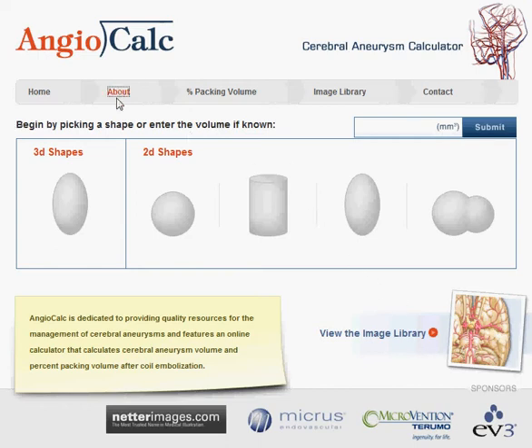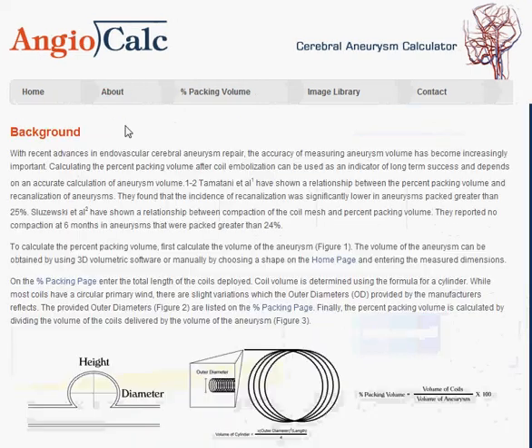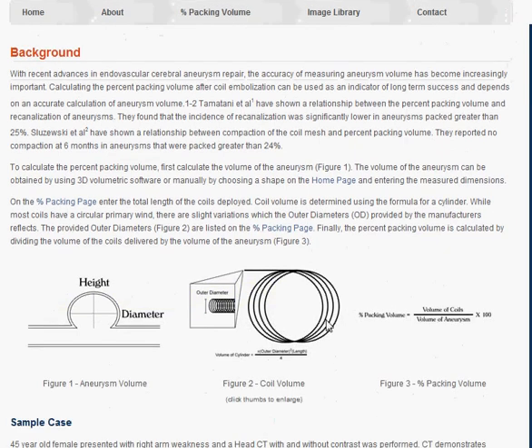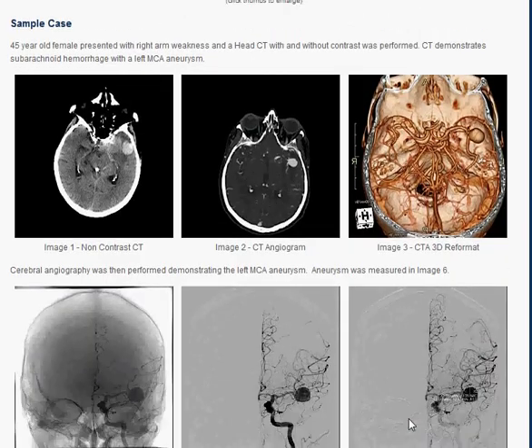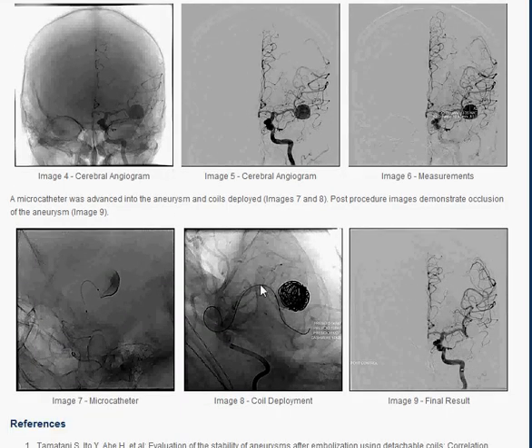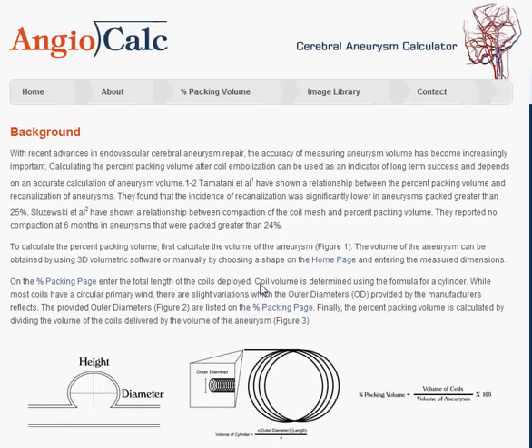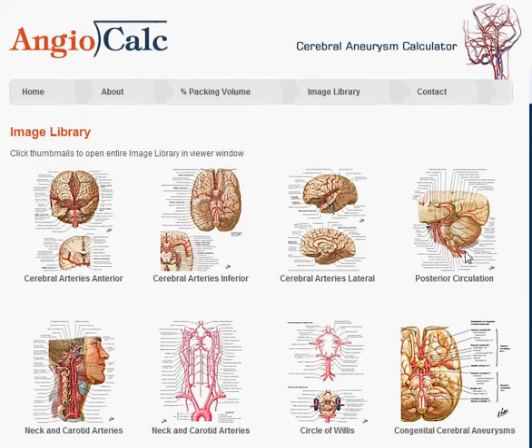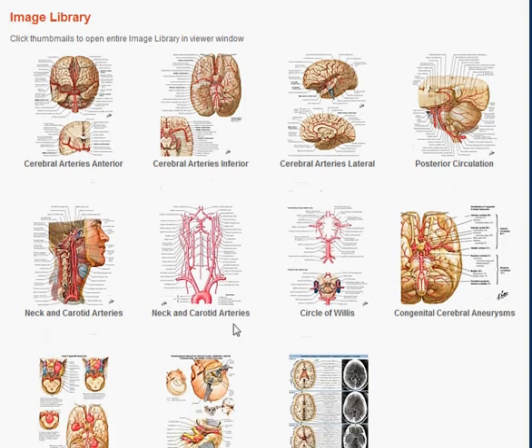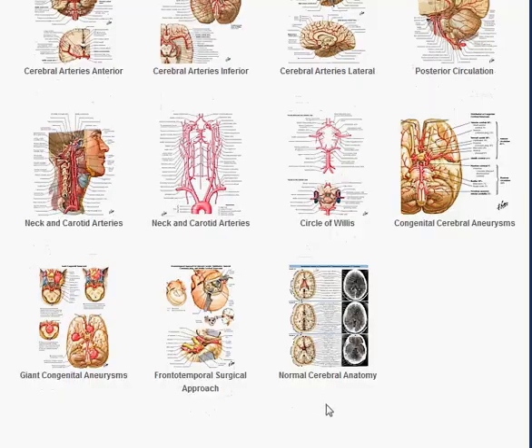Coming back to the home page, a couple other features of the site: under the about section there's some background information about cerebral aneurysms and a sample case. Under the image library there are also a few Netter images that will launch in a separate viewer if you click any of those.